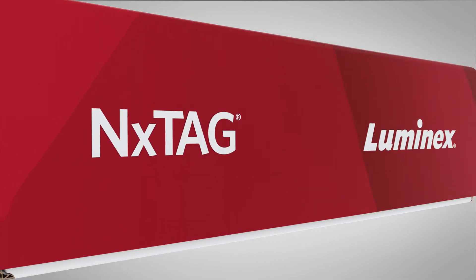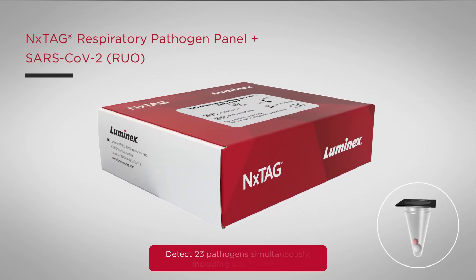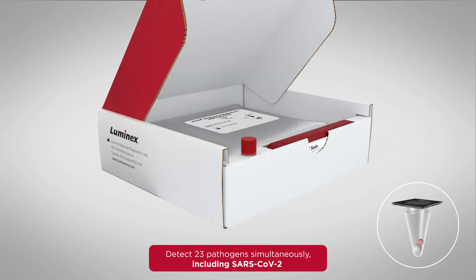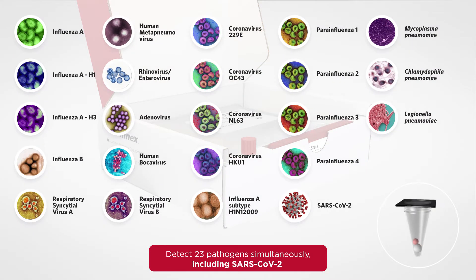Introducing the NEXTAG Respiratory Pathogen Panel plus SARS-CoV-2. This comprehensive assay detects up to 23 respiratory pathogens simultaneously, including SARS-CoV-2, in a closed-tube, easy-to-use system.